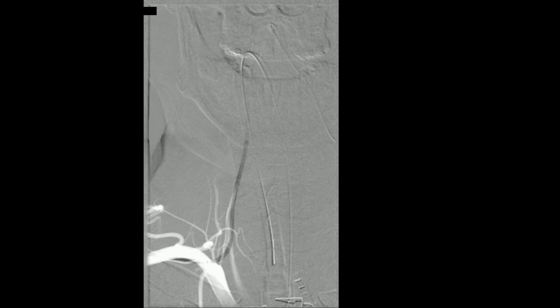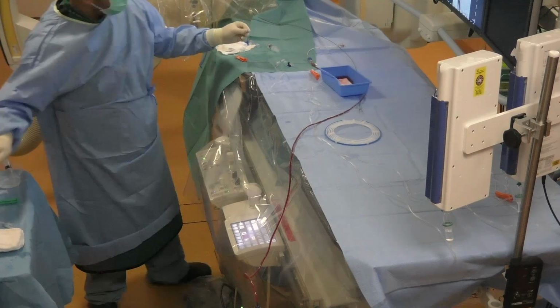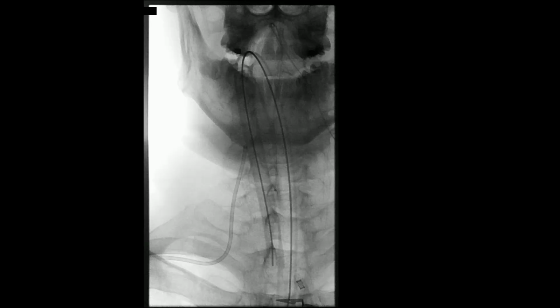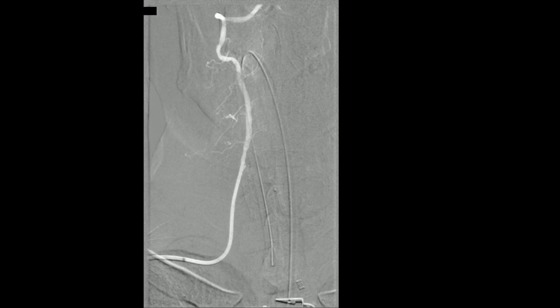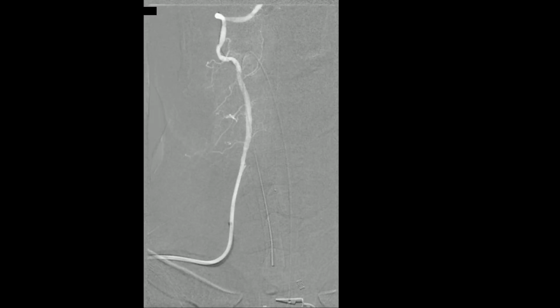Now we can perform a 2D angiogram to see the results in the distal part. As you can see, there is no thrombus material in the lumen of the vessel. Now we take a microwire, Synchro Select Support 14, and push it through the guide catheter to the V3 segment of the vertebral artery and perform an aspiration thrombectomy through the guide catheter, and the microwire will be used as a rail. We perform a 2D angiogram, and as you can see, there is no thrombus material.